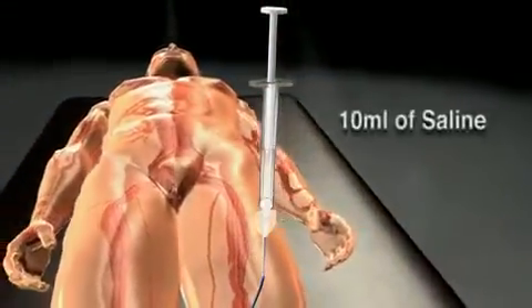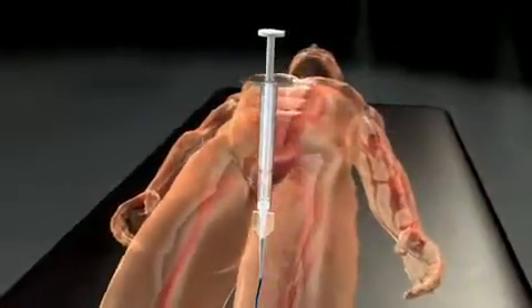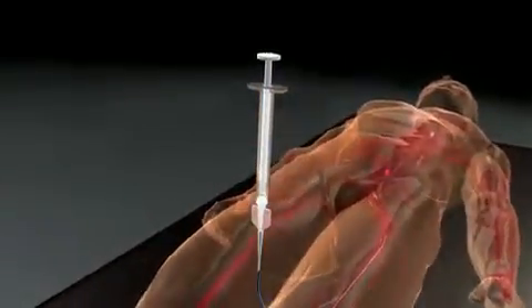Because Onyx will reflux during the procedure, it is important to have clear visualization of the catheter tip and any vasculature that must not be occluded by Onyx. Establish a reference image revealing the distal catheter shaft, nidal angioarchitecture, and venous outflow. Flush the contrast from the microcatheter with 10 mL of saline to expel the contrast media, and leave the syringe connected to the catheter.